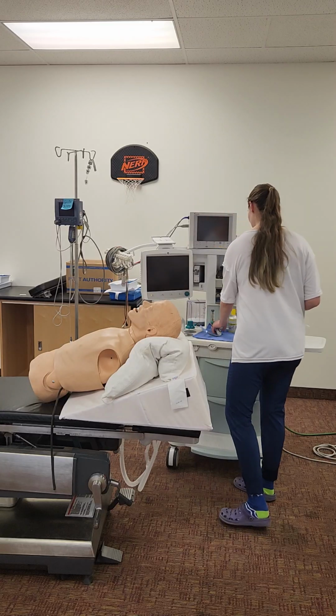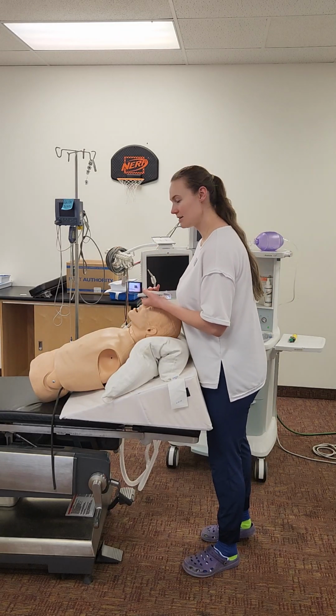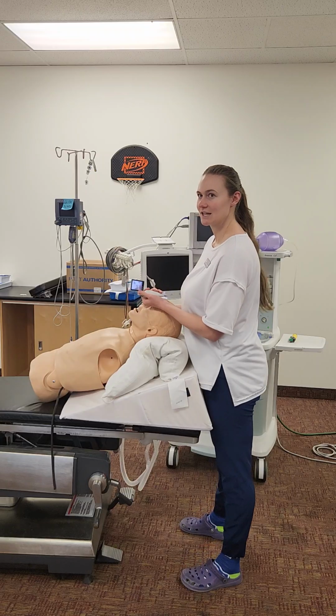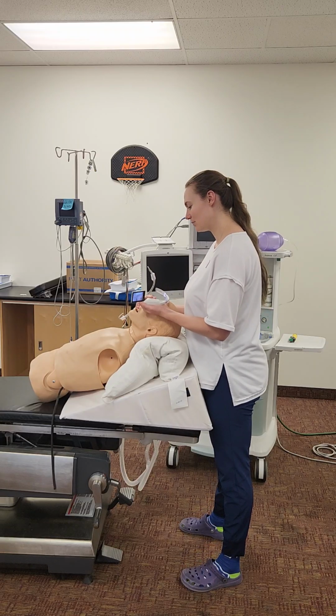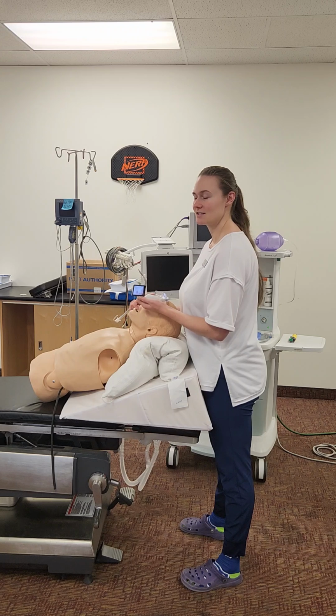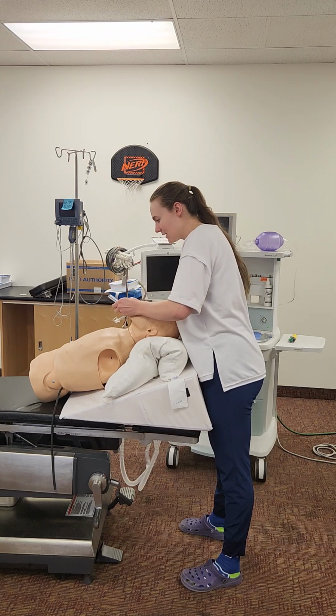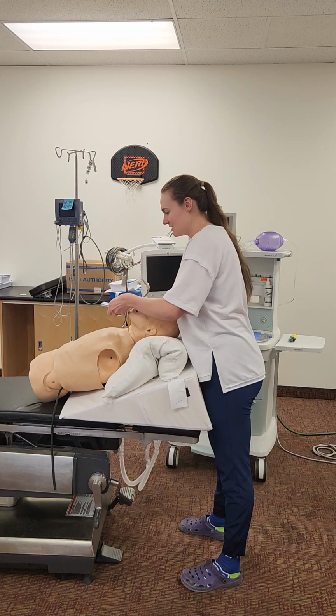So I'll just take my McGrath straight away and my 8 tube with stylet and lube on it, and then I will just optimize his positioning also before, and align his airways, use a jaw thrust if I need, but I'll just go ahead and see what we can see.